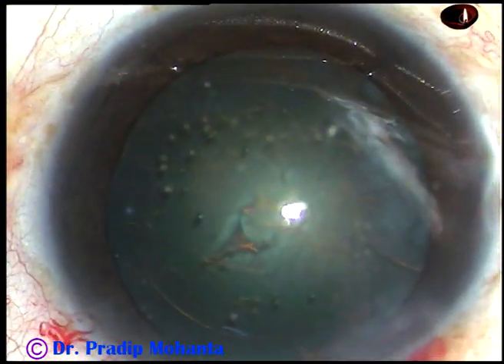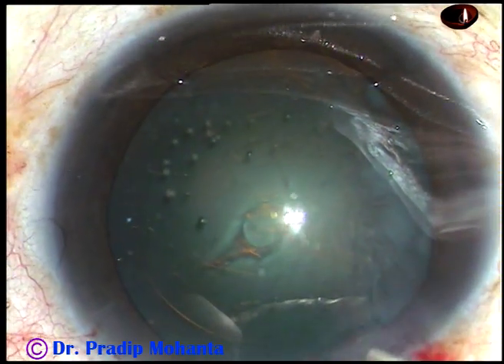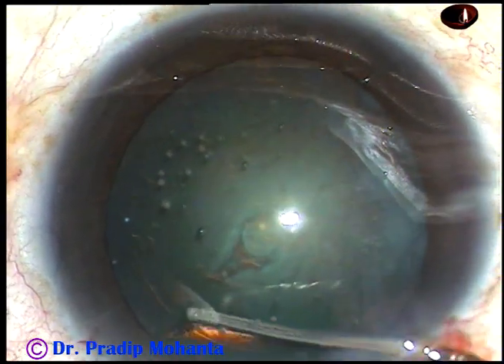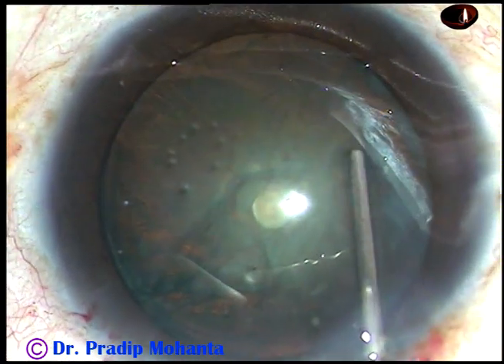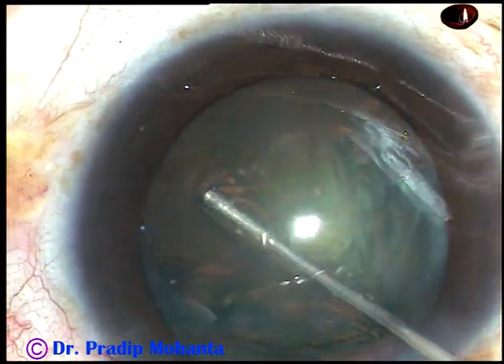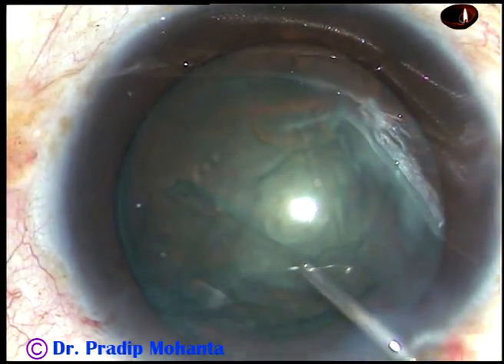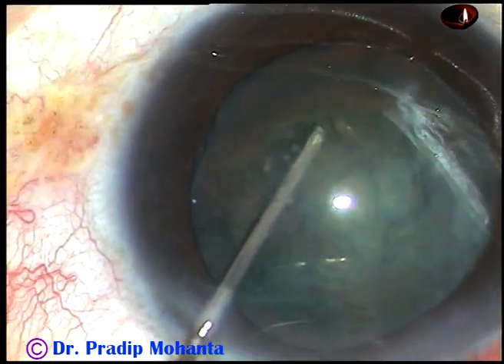And now, hydrodissection. Fluid wave is passed just under the anterior capsular rim and we can see that it goes to the opposite side. The nucleus is tapped. The fluid comes anteriorly, indicating that hydrodissection is complete. The nucleus is mobilised.